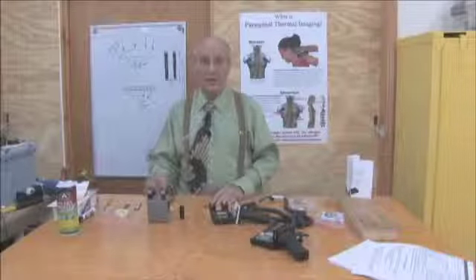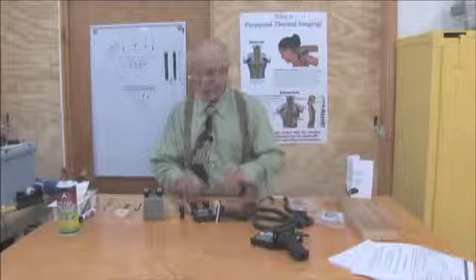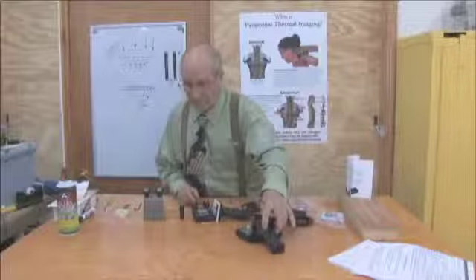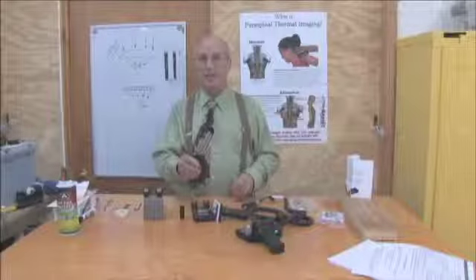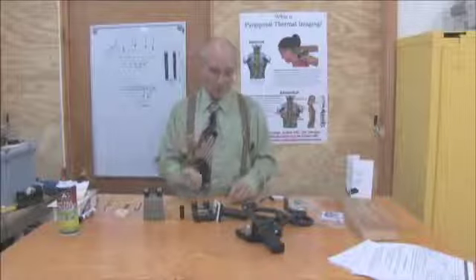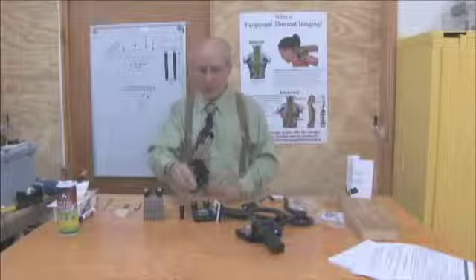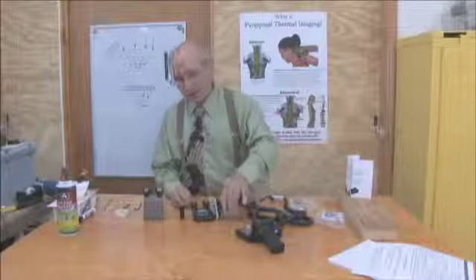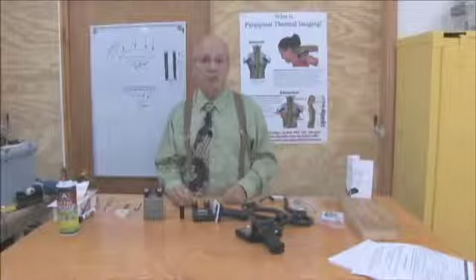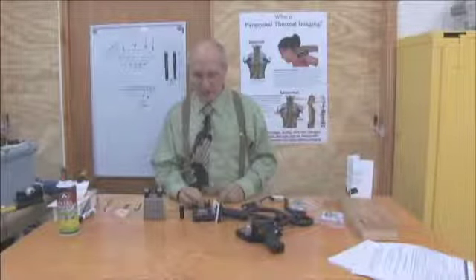Invariably someone sometimes drops a scanner. And it is designed actually to fall apart, as these two have. The scanner handle is held to the head with 4 plastic screws, and they must be plastic. The screws that come with the scanner are designed to, 1, perform a thermal barrier between the head and the handle, as the gasket does. It also performs an electrical barrier so that the head is totally isolated thermally and electrically from the handle.